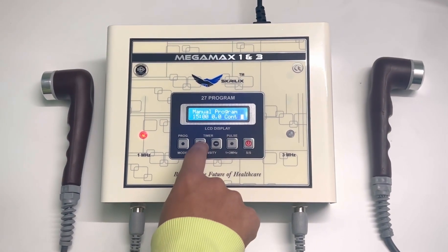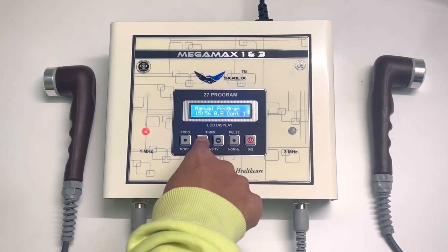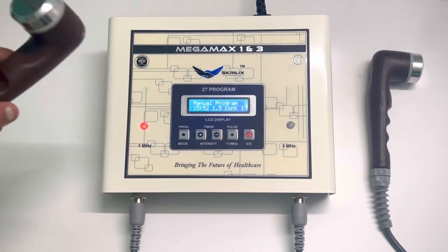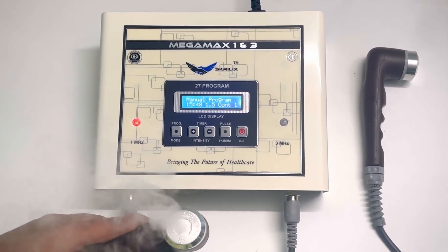If you want to use it on 1 MHz, press the start button and start increasing the intensity. This is 1 MHz — as you can see, it's working.